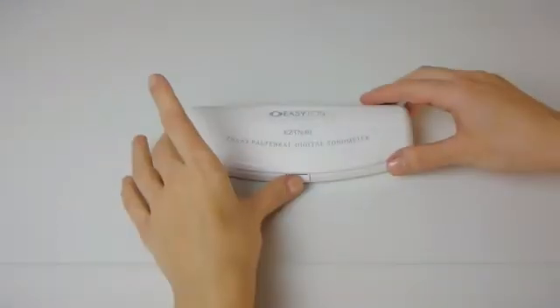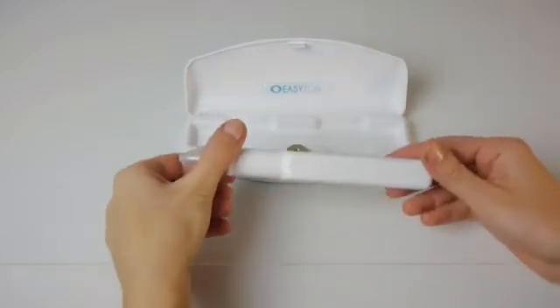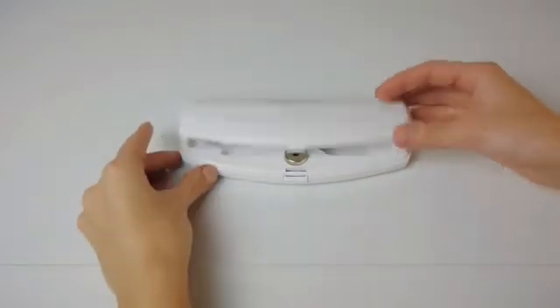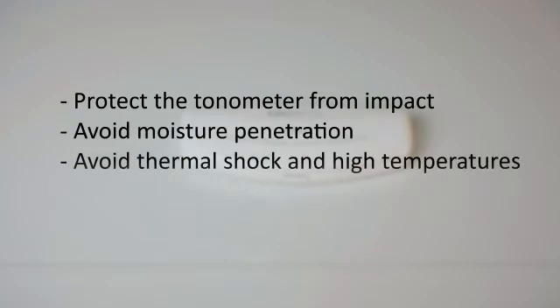Safety measures. Make sure there are no mechanical damages on the tonometer housing and rod. If you find any, do not use the device. Protect the tonometer from shock or impact. Make sure that no moisture gets inside the tonometer. Avoid exposure of the device to thermal shock or high temperatures.